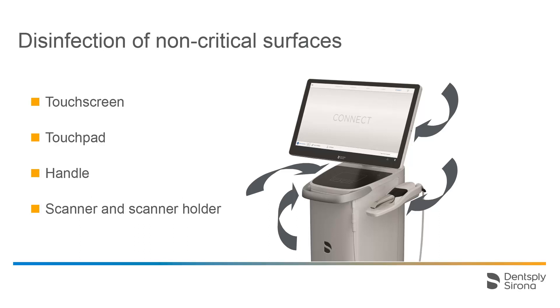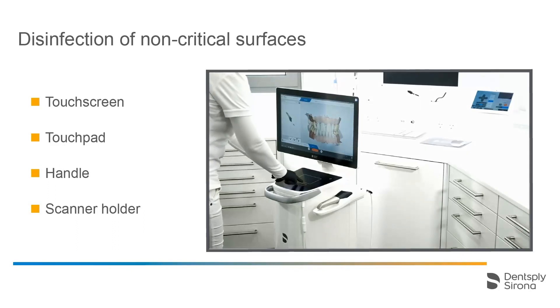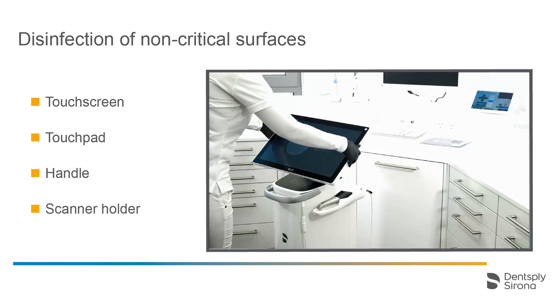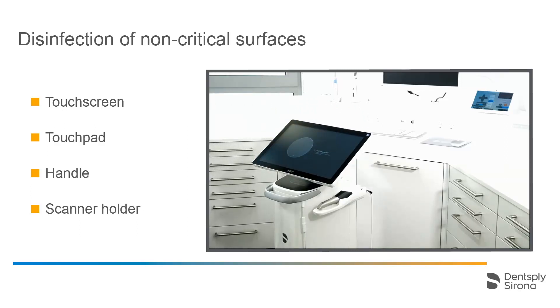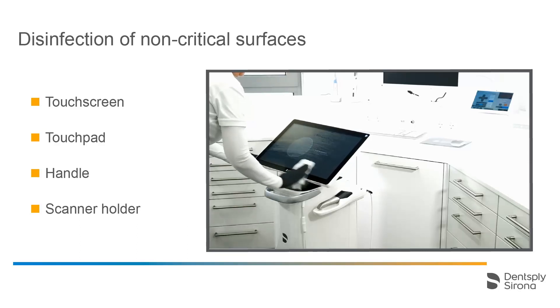You will see a short video for further explanation. To ensure that we don't accidentally start any function with the touchscreen, we will freeze it first. To do this, the left and right mouse buttons of the touchpad are pressed simultaneously for a few seconds.